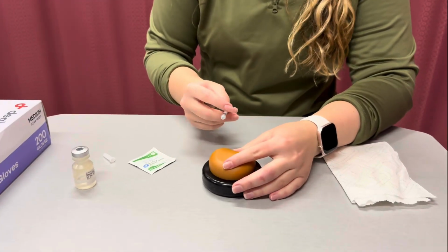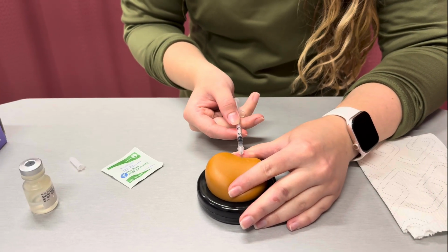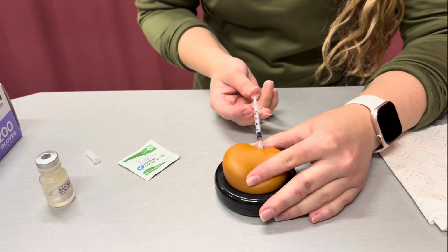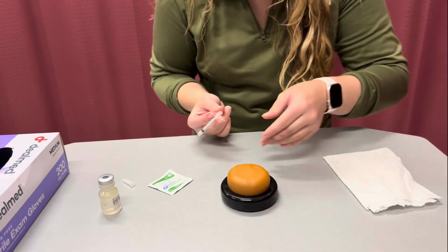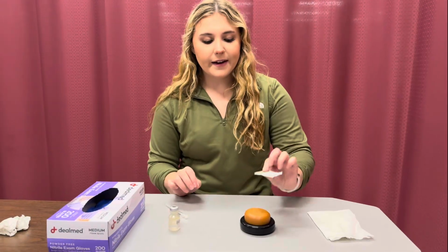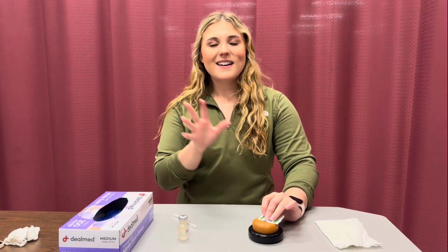My thumb right here. Kind of pull back on my patient's skin a little bit. Go bevel up. There we go, and there should be a little bleb. Okay, I would apply a little dry gauze on the injection site to clean off any blood.